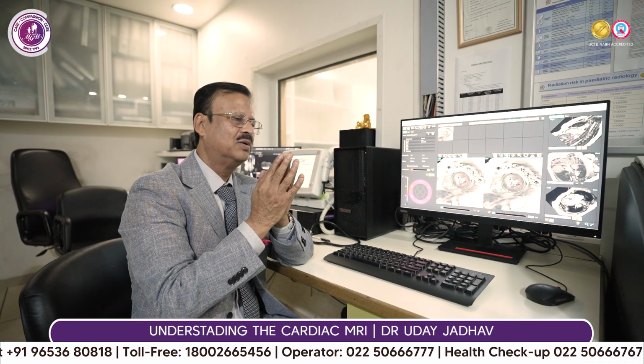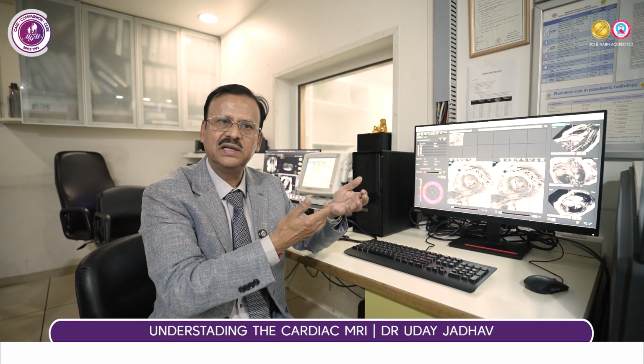Cardiac MRI goes a long way. It's complementary to our cardiac CT. Once we have the CT images that show the arteries and the various parts of the heart, and then we go to cardiac MRI and we study the function of the heart, that in toto and in reality becomes the entire understanding of the heart.